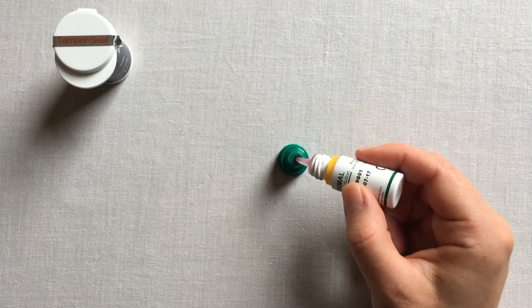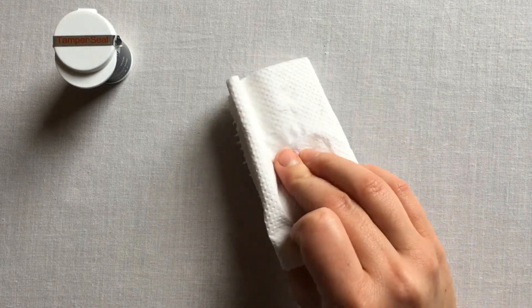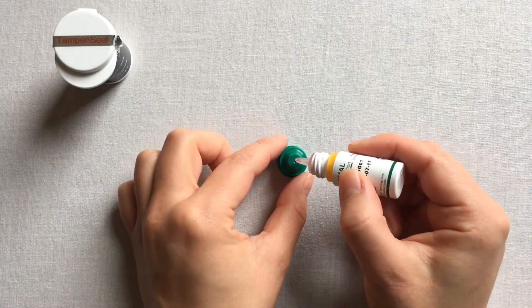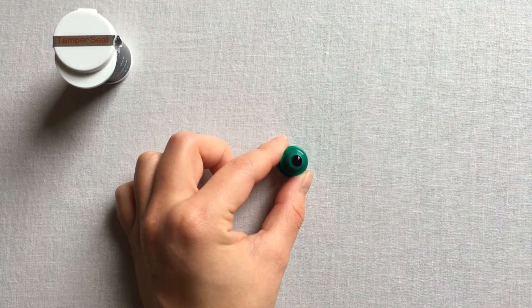Squeeze out the first droplet onto the lid top, then wipe it off. Squeeze out another drop and again place it onto the lid top. Do not perform your QC test directly from the solution vial.